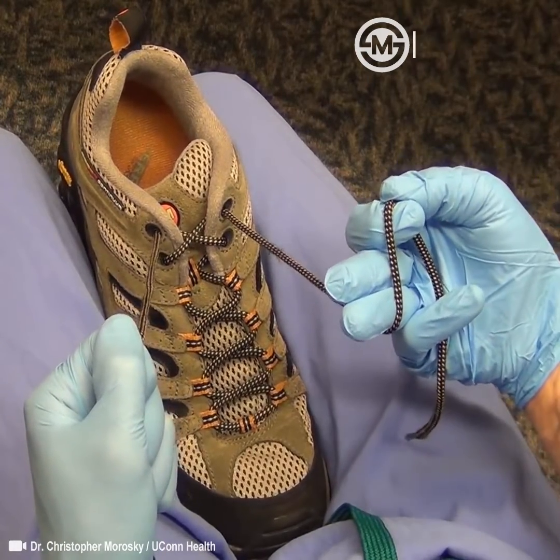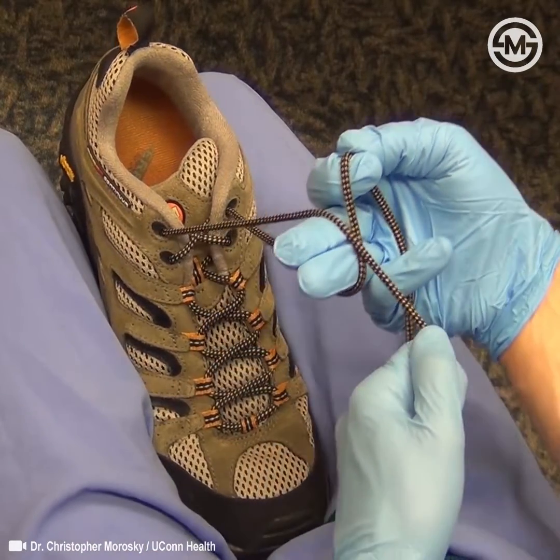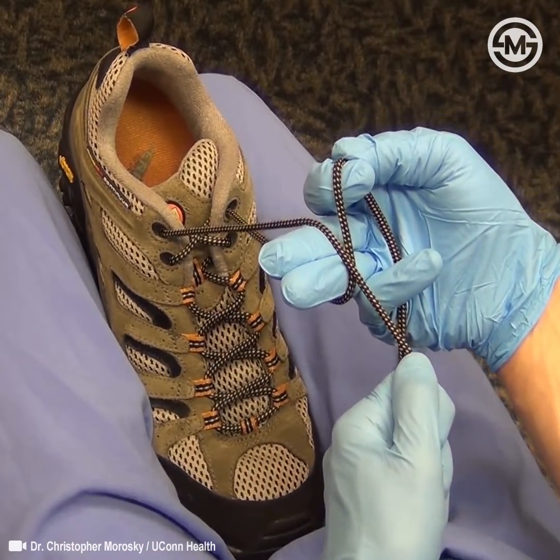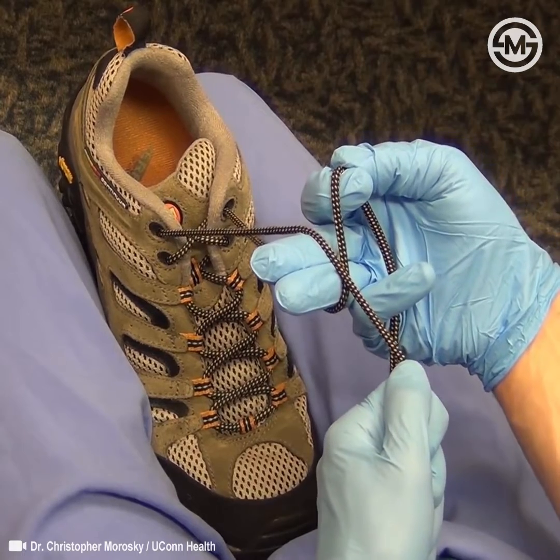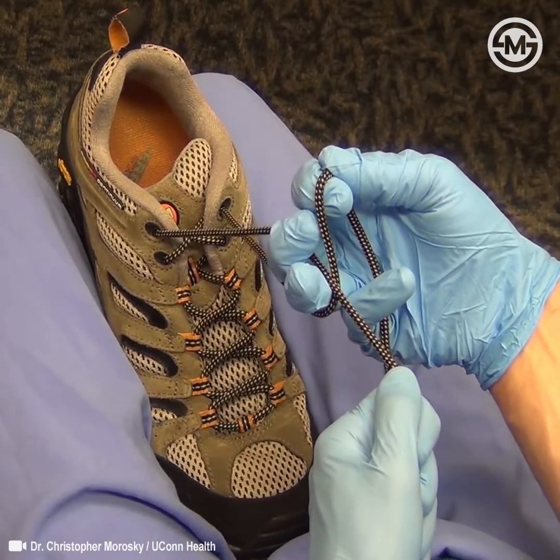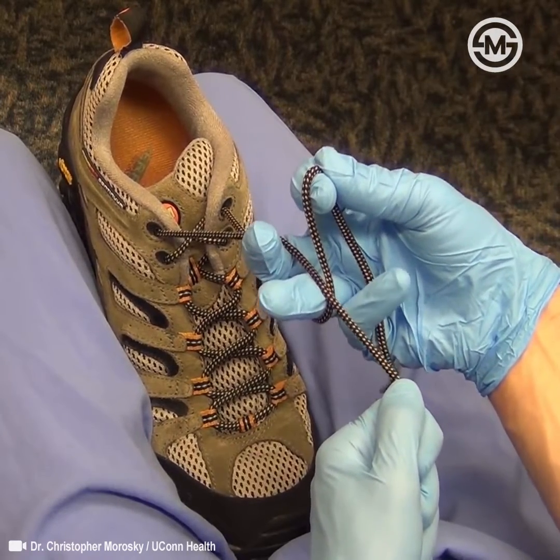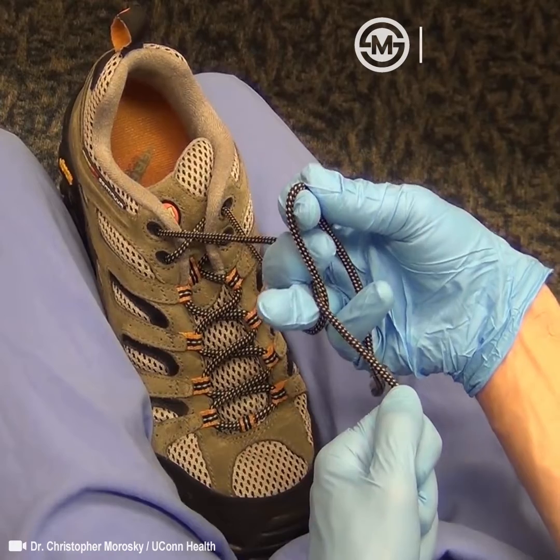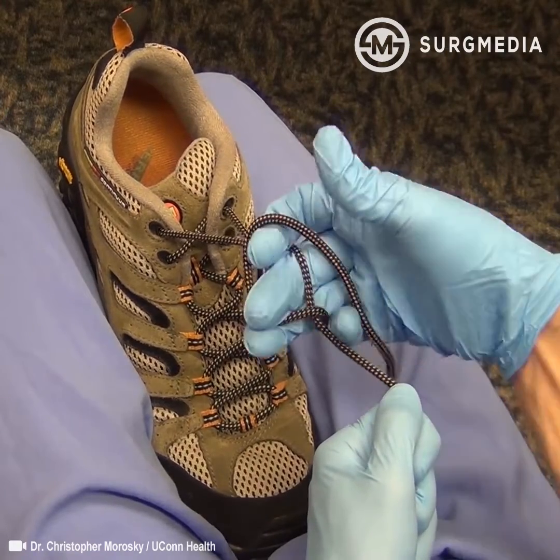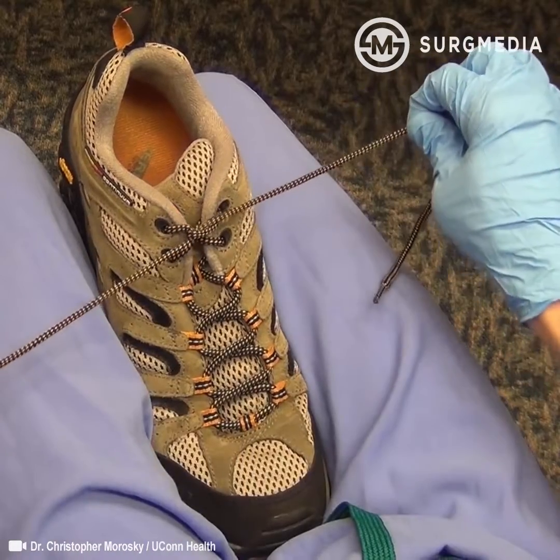You can see this is going to create half of your suture circle. You want to bring the other suture around to create the full suture circle around both your fingers, and then you need to bend your middle finger back over the loop of suture. Grab the little part being held between your middle finger, pinched between your index finger and thumb, pinch it, and then flick that little part through the loop of suture circle.